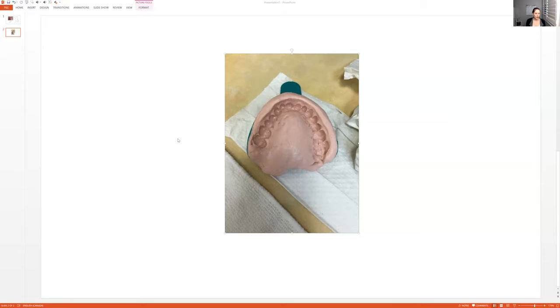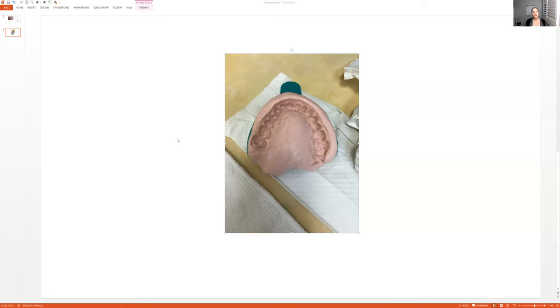So I will usually say to them, okay, I'm just going to try in trays first because I need to see which ones fit your mouth. So there's nothing in here yet. I'm just going to try in the trays first. So they know, right? So then you will find the tray that fits the top and then find a tray that fits the bottom.